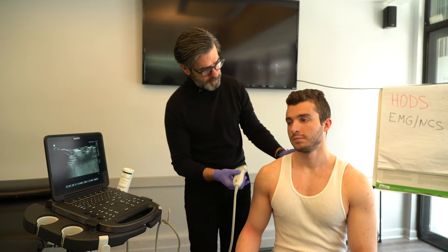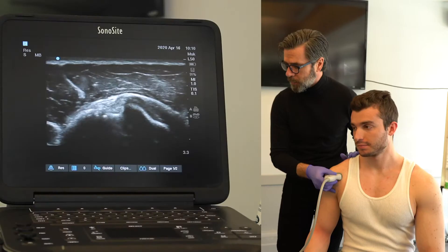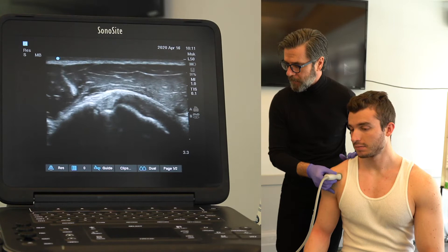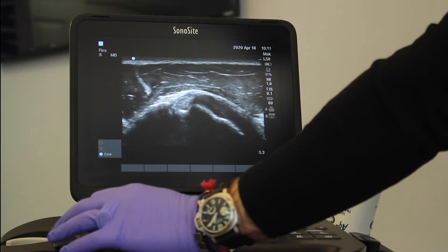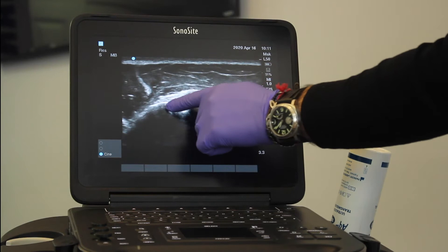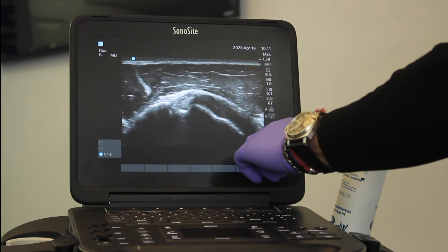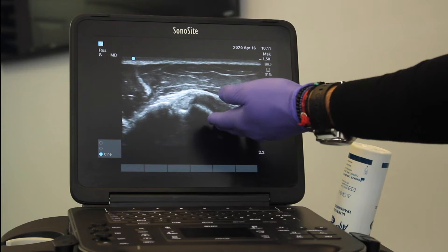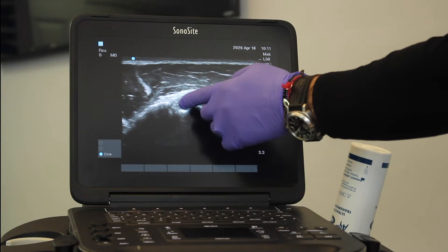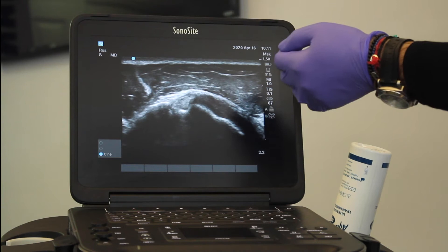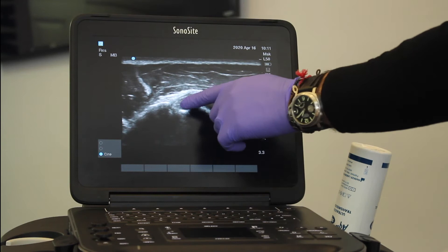I'm going to look for the bicep tendon in the short axis and occasionally freeze the screen to explain what I'm looking at. Right here is the bicep tendon, sitting in the bicipital groove. For orientation, this is the lateral part of the body, and this is medial. Going from bottom to top, you go from bone — this is the humerus — then the bicep tendon, then muscle — this is the deltoid — and then fascia, fat, and skin. That's how we orient ourselves on the grayscale image.